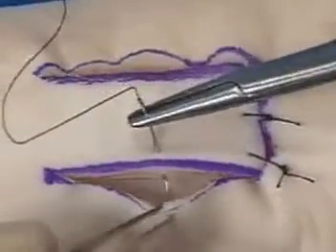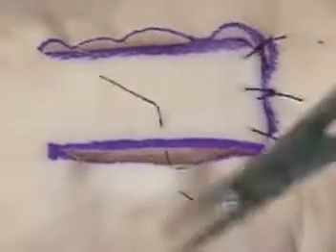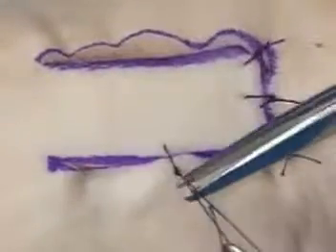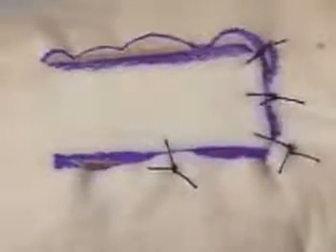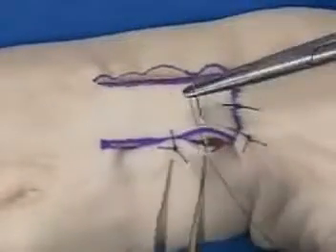We will then close this with the principles of halving. The first or central suture is placed in the middle of the inferior edge of the flap and in the middle of the corresponding skin flap. The two halves on either side are still uneven, but less so.